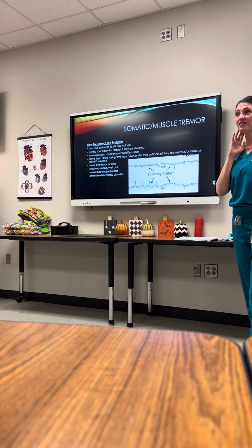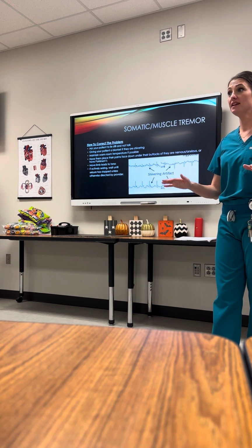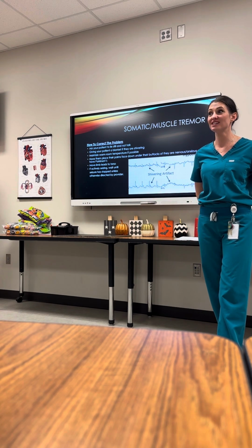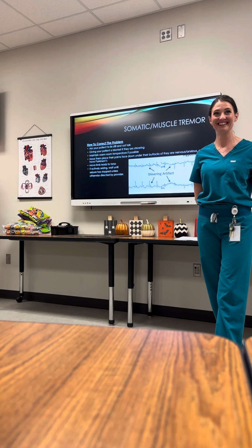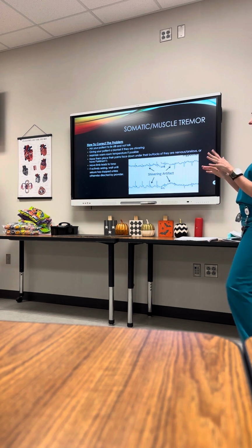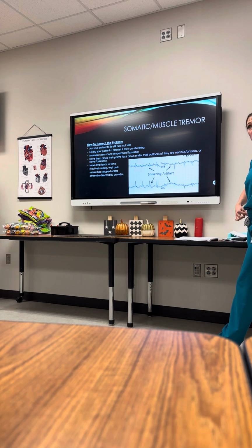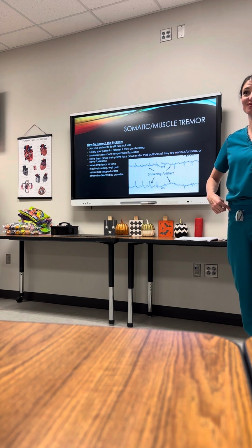Here's one that I know we've gotten questions about. If your patient has Parkinson's or a really bad, uncontrollable tremor, have them put their hands face down, palm down, under their buttocks. If they are shaking or tremoring for any reason, we can move limb leads to the torso. We already know about that. If they are actively seizing, wait until the seizure has stopped unless otherwise directed by the provider.